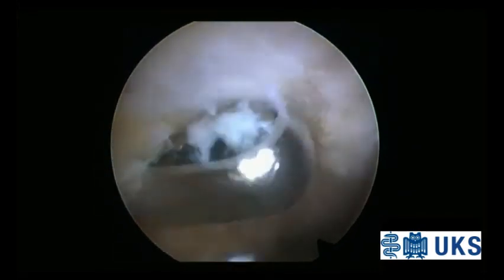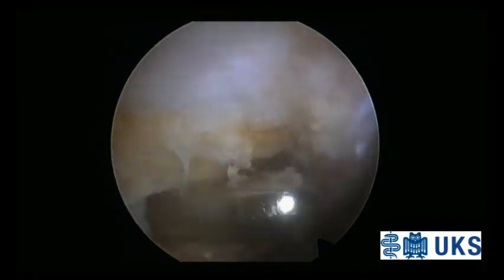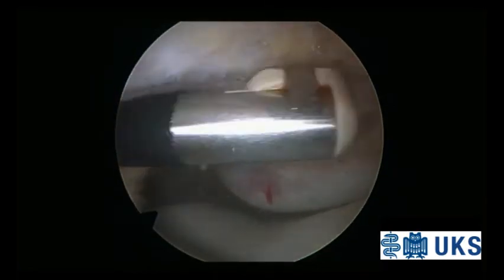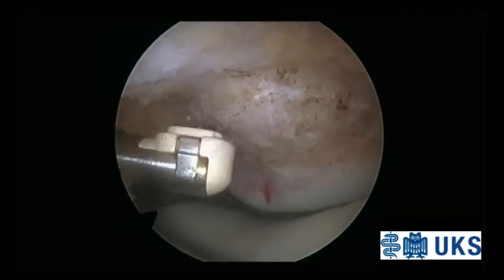The bony tip of the patella is assessed with an examination hook after clear identification of the lower patellar pole as well as the patellar tendon. The bony tip — the non-articular patellar surface — is verified and marked under arthroscopic and fluoroscopic view using a needle.